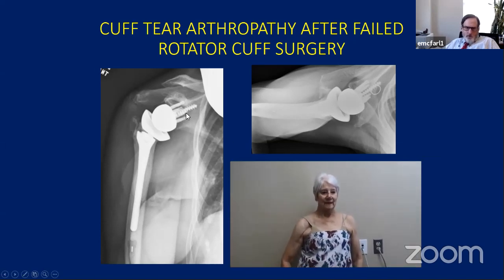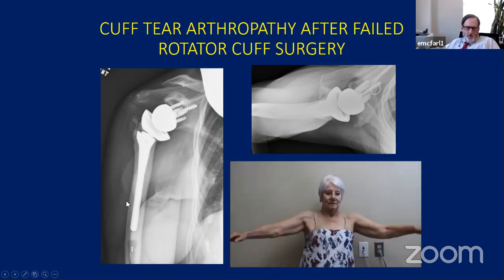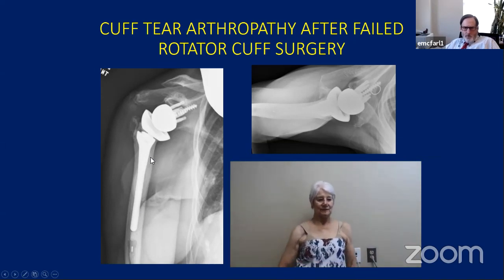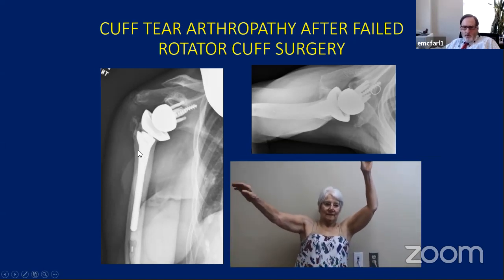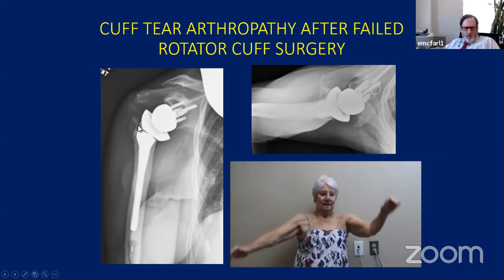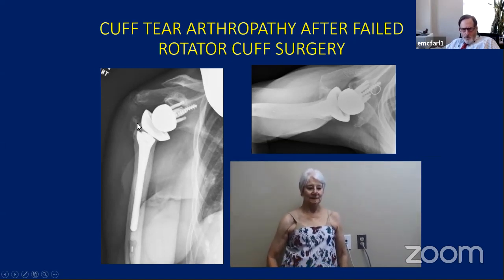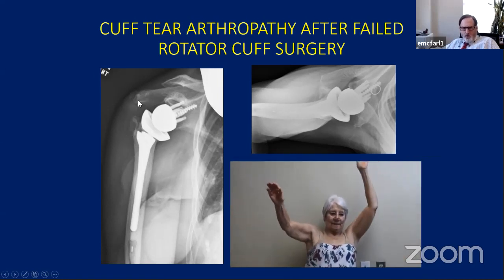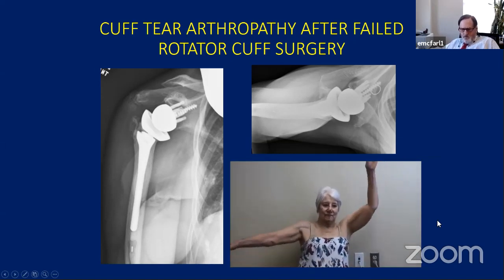Here's again, you notice there's a little inferior tilt on the base plate. And this is early on in the DJO prosthesis. They recommended, as did people in Europe, they originally were cementing all the stems. And these days we press fit everything. She had some trouble with her greater tuberosity. I don't think we broke it off, but again, you want to try to preserve the greater tuberosity because it keeps tension on the deltoid. But anyway, her motion is not fantastic, but she's pain-free and she's very, very happy.